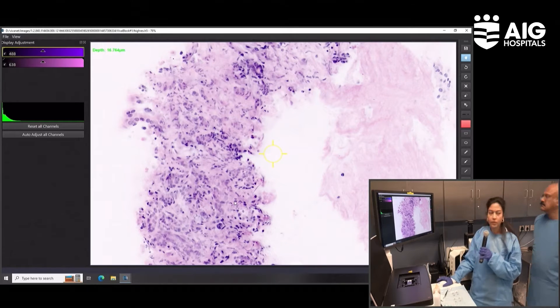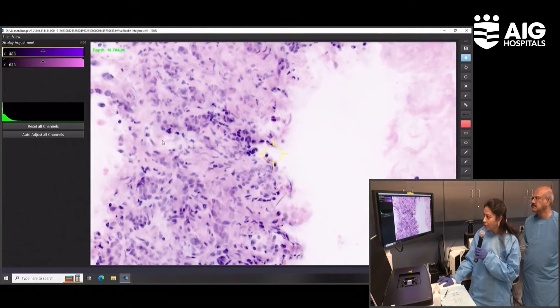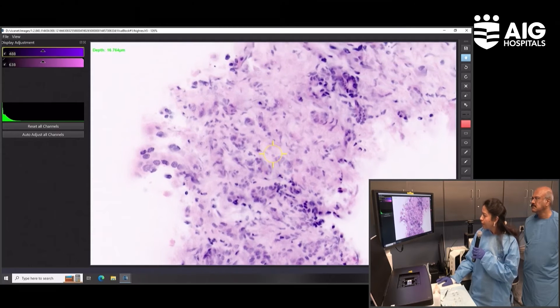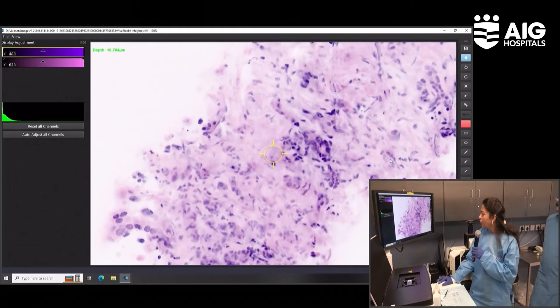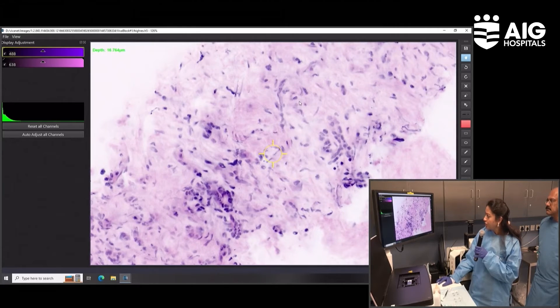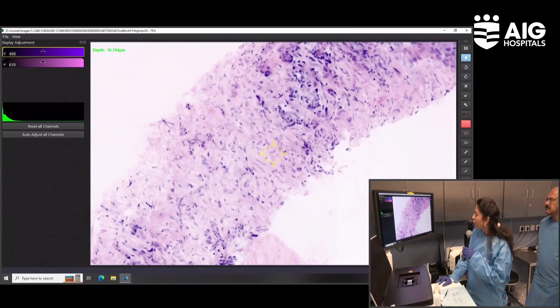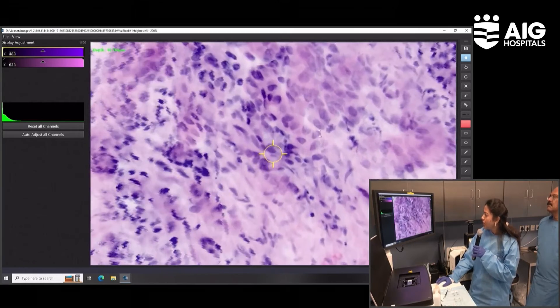What is the diagnosis on first look? In pancreatic tissue, the most important thing we look for is cellularity. Increased cellularity indicates a neoplastic lesion, because in benign conditions like chronic pancreatitis there is more desmoplastic tissue rather than cellularity. You can see a vague gland pattern and anisokaryosis — big cells — and an acinar pattern of arrangement. The gland-like pattern is evident. Now in this area, there is total loss of gland pattern and sheets of cells with anisokaryosis.